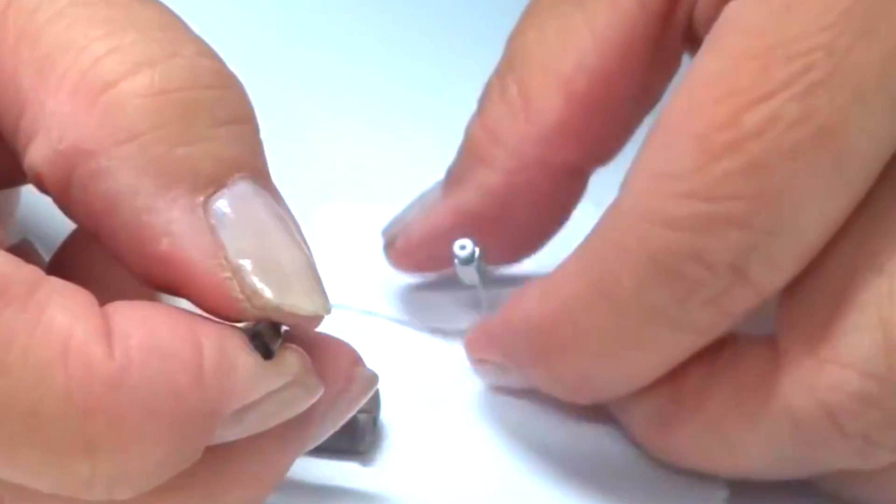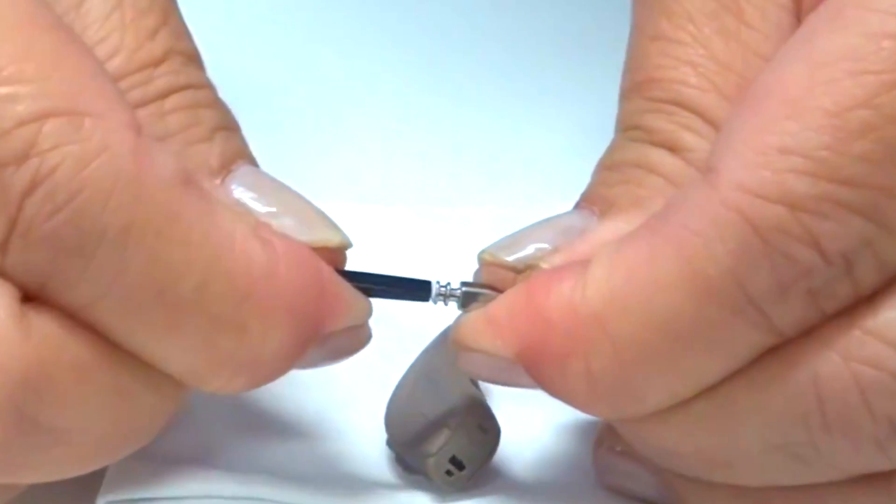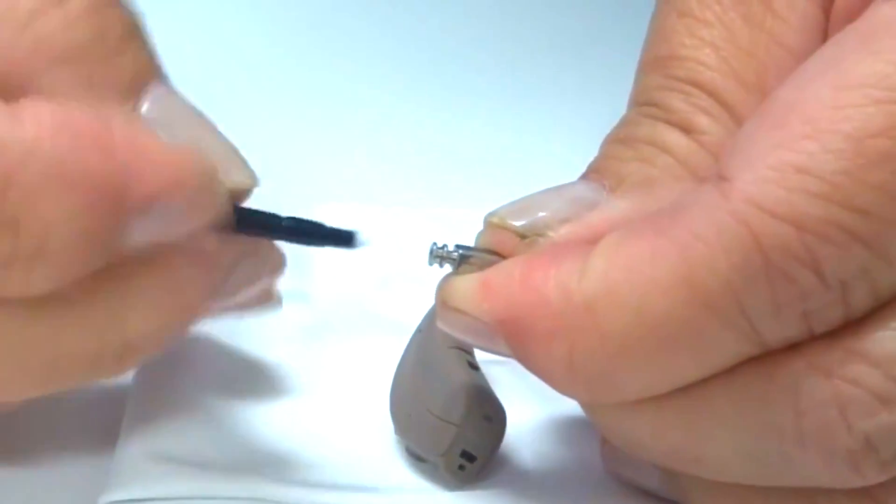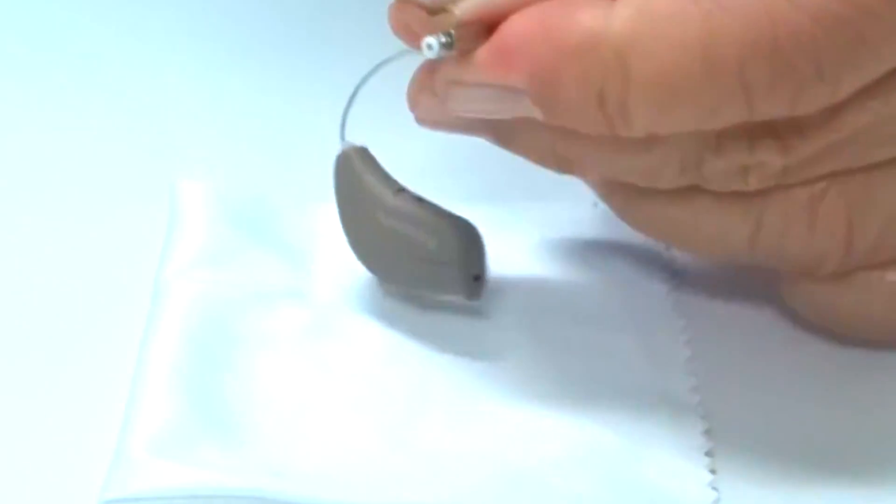The end of the replacement tool is firmly inserted into the wax guard to remove it. The replacement tool is then flipped, which already has a new wax guard preloaded. Firmly insert the new wax guard into the hearing aid receiver.